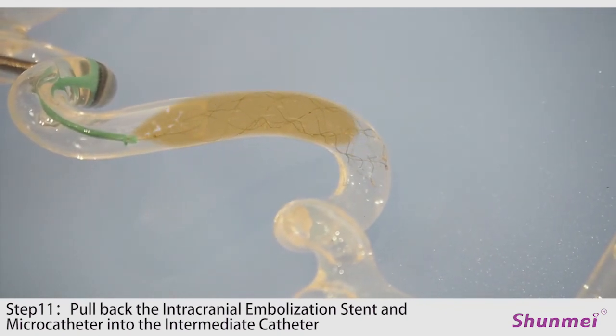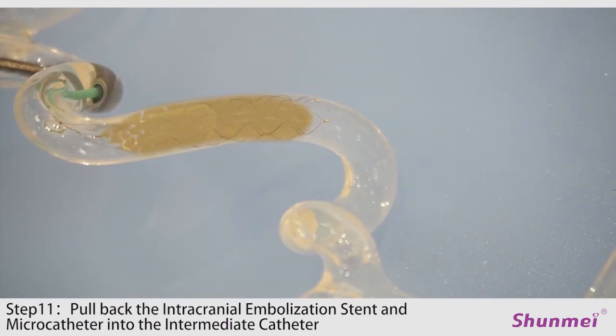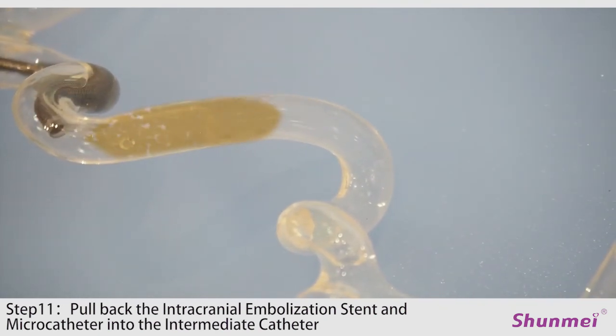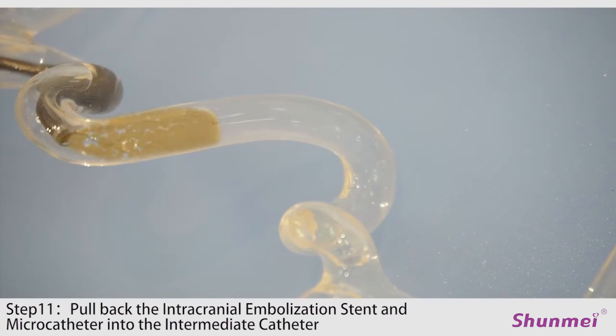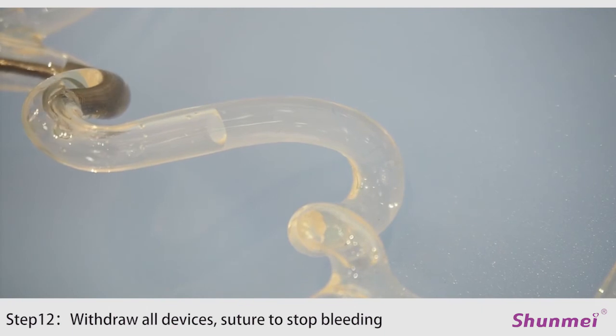Then, pull back the stent and microcatheter into the intermediate catheter. While the intermediate catheter is given negative pressure for suction, and the intermediate catheter was withdrawn from the body by maintaining the negative pressure. Then, withdraw the other devices in turn.